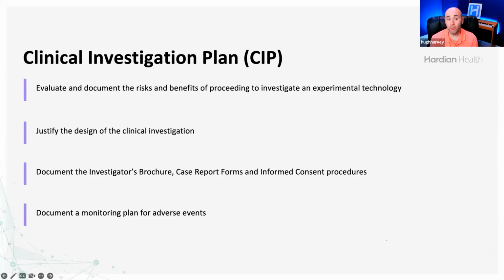You have to build this from your evidence base that you've already gathered. So part of the CIP will be your intended use. Part of it will be the clinical benefits and the associated risks that you're aiming to measure. And part of it will be based on the early feasibility data that you have, and also successful analytical validity outcomes. So you've proven that your device works in practical terms through analytical validity. You've proven that there is a scientific association between what you're claiming and the clinical targets. And you've proven in the literature that there is this association. So now it's time to write down an investigational protocol.